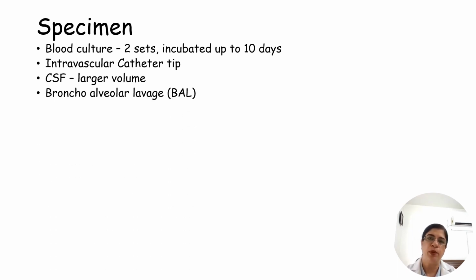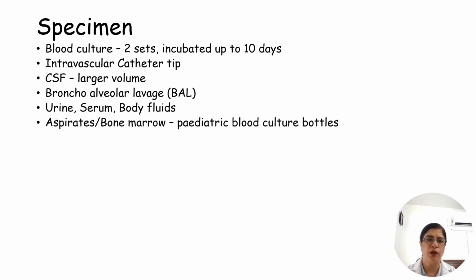BAL sample will give a lot of information for all pulmonary infections, and it can be used for microscopy, culture, antigen detection, and molecular testing.